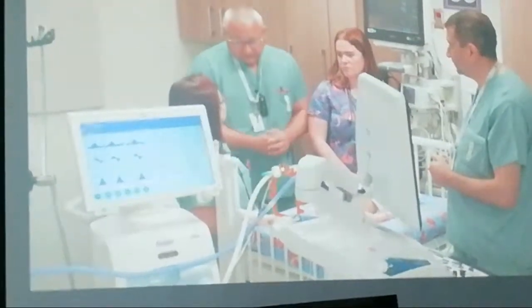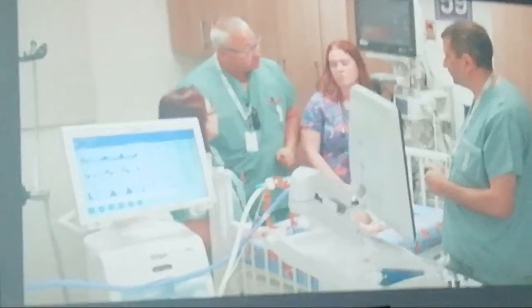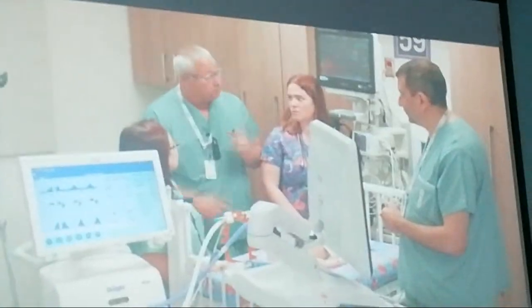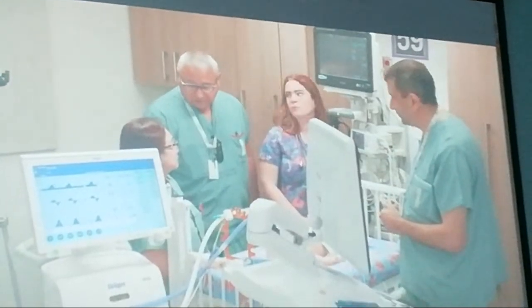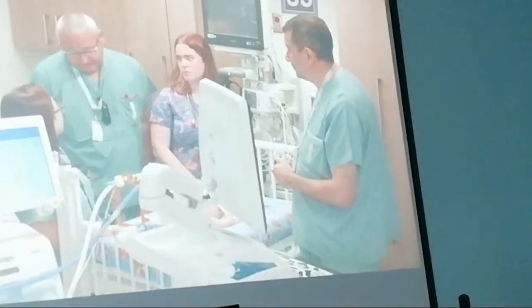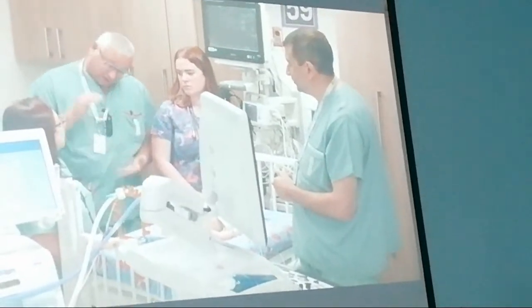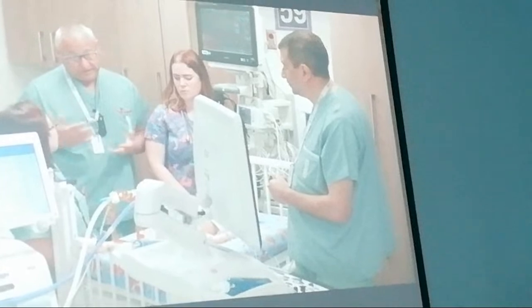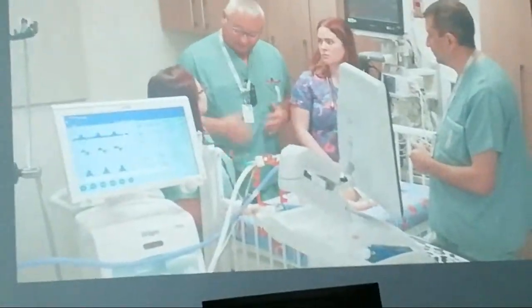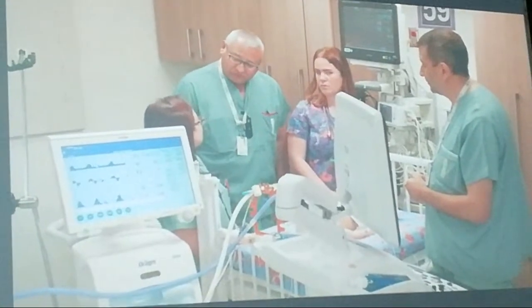Well, I'll target sats again at least 88%, 88 to 94, at that lowest FiO2. Make sure your blood pressure doesn't change and the heart rate stays the same. Okay, and those are the ideas, but I can go higher. And we just say if we're at 8 now, 15 is high. And then, of course, watching ventilator parameters to make sure nothing is out of sorts.